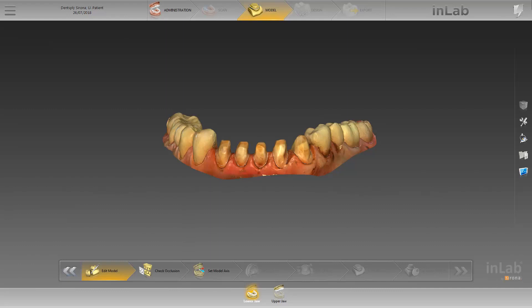Since the treating dentist has already defined the preparation margins in the CEREC software, these are automatically transferred into the INLAB software and displayed.